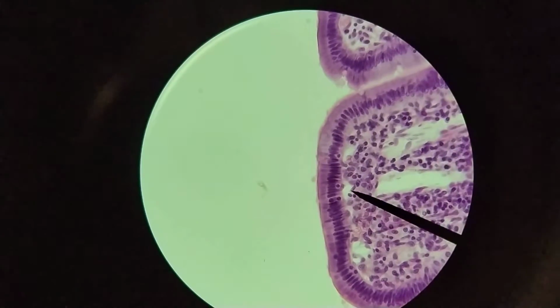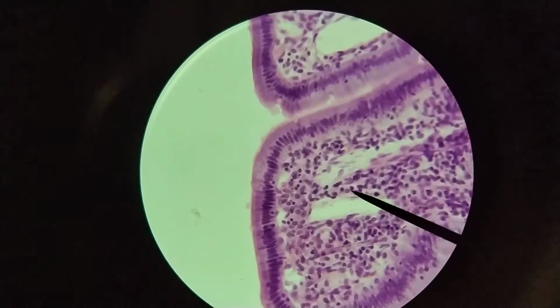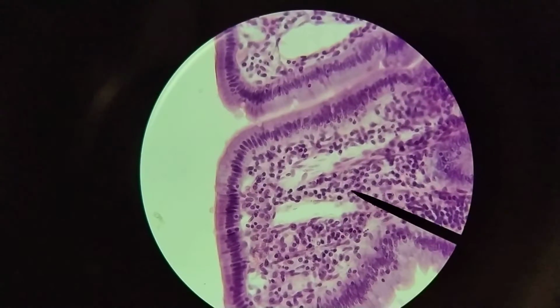Then beneath that we have capillaries, and we have lots of these nucleated cells. And again, all of this is lymphocytes, macrophages, eosinophils, and so on. Okay, so it's your immune system protecting you.